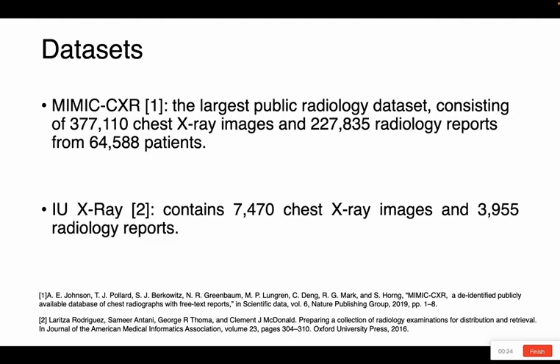We evaluated our method on the MIMIC-CXR and IU X-ray datasets. MIMIC-CXR is the largest public radiology dataset. It consists of 377,110 chest X-ray images and 227,835 radiology reports. The IU X-ray dataset contains 7,470 chest X-ray images and 3,955 radiology reports.